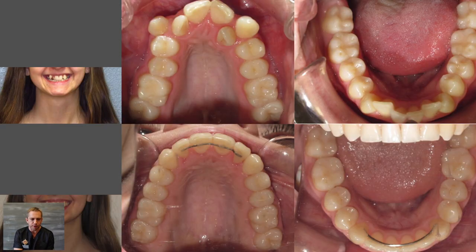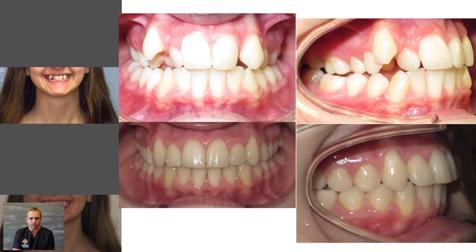In the before and after photo, you can see on the smiling view just what a big impact widening out that upper arch had — it really helped fill out her smile. On the upper arch, you can see just how much wider we were able to get everything with that expander. On the bottom, she didn't have too much crowding to begin with, so that was really more about alignment of the front teeth. And from the front, you can see the big change — we were able to get that tooth brought forward, widen things out, get everything to fit, and with the bite and alignment we got everything locked in much better.